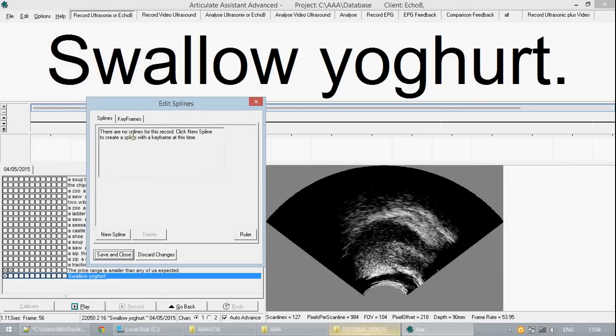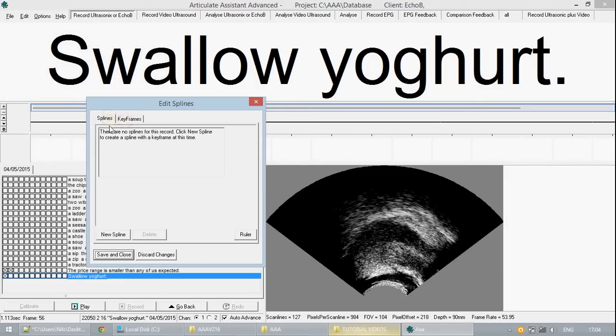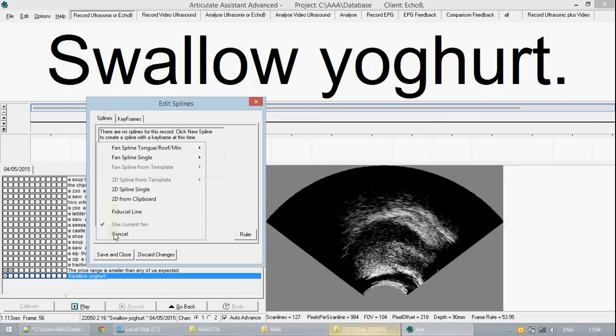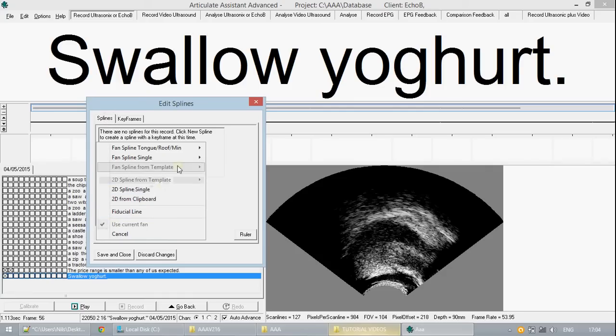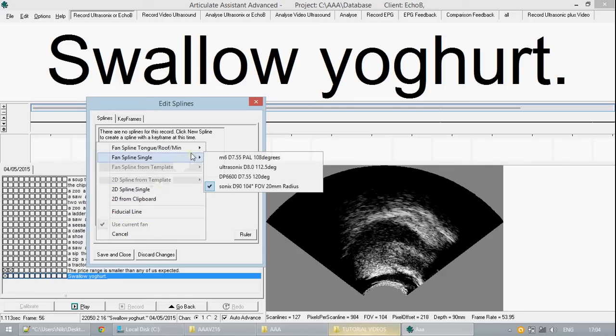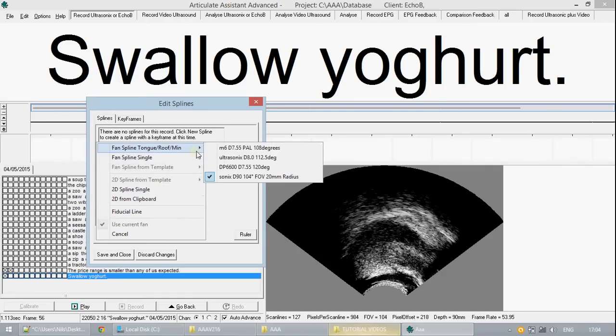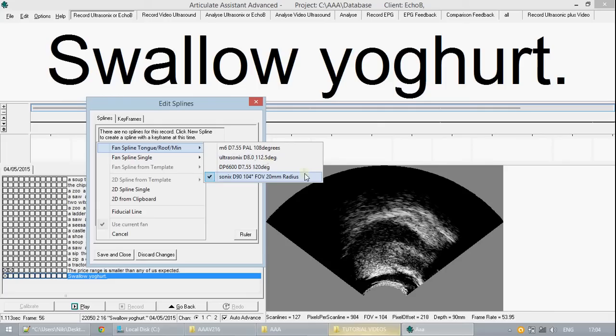The only options you have at present in either tab is to create a new spline. You are given options here. Advanced users can select this one specific to their purpose but for here and for most users the one highlighted by a tick in fan spline tongue roof min is the one that should be chosen.